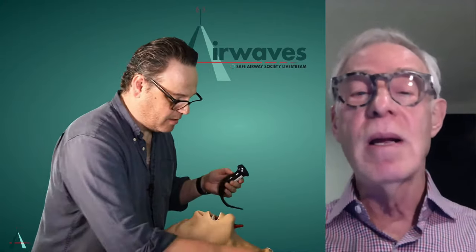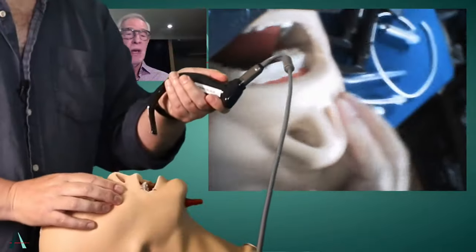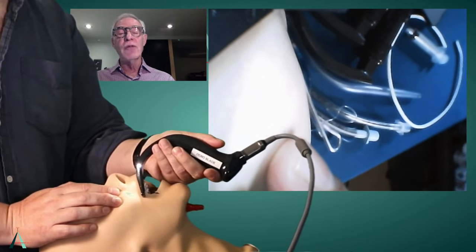That's a function of the distance between, I think you can demonstrate that on the mannequin. Do you understand what I mean? Yeah. Sorry, I drifted a bit when you said which actual position you were going to use. So you're in a sniffing position or a neutral position? I put the patients who have one or more of those challenges, a big chest, very large breasts, a short neck, reduced cervical extension, I find that if their head is elevated on a pillow, the proximal part of the handle will often abut on the patient's chest. Exactly. And by dropping their head, by taking the pillow out, that's less of a problem. It gives me several extra centimeters of space.